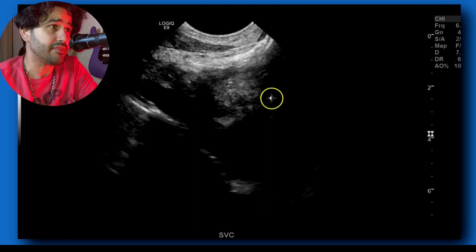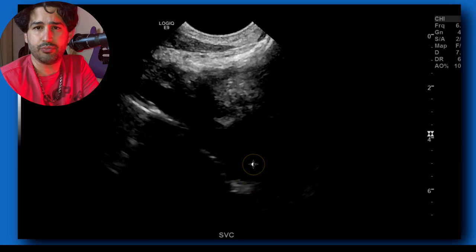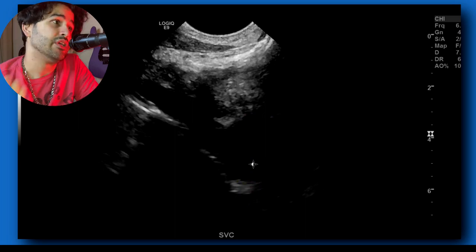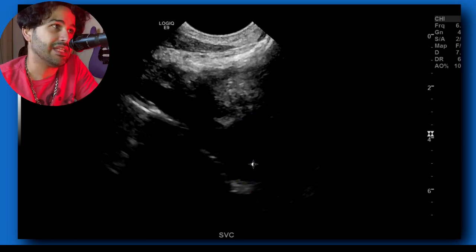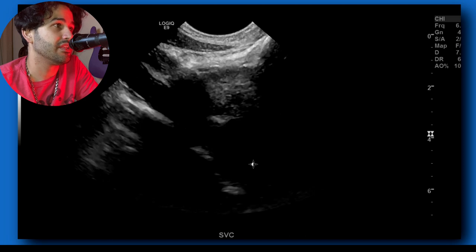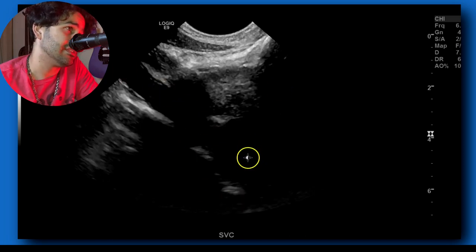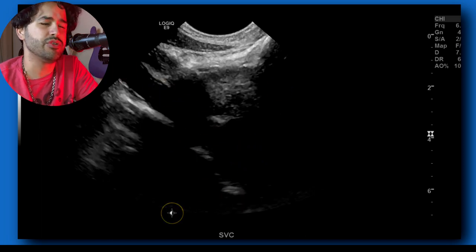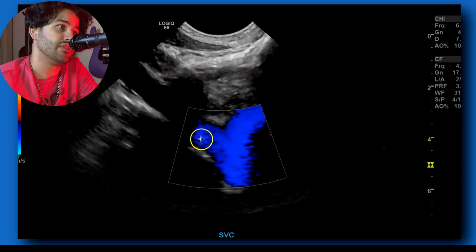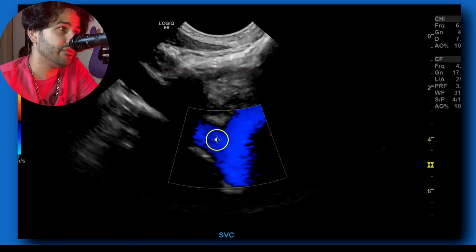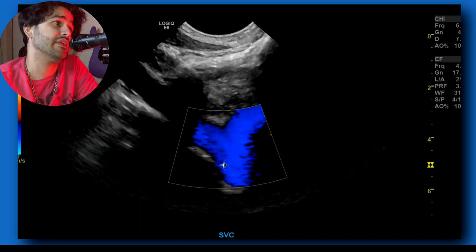Left brachiocephalic, and then the SVC — superior vena cava — which goes into the right atrium. Take that grayscale image. Once you put the color doppler, it really comes out. That's the color doppler; it looks beautiful — kind of in the shape of a Y.